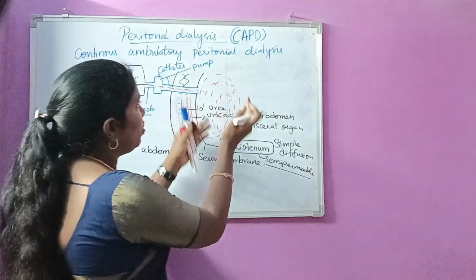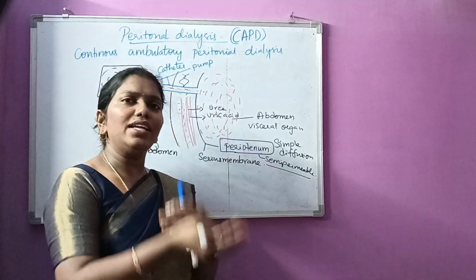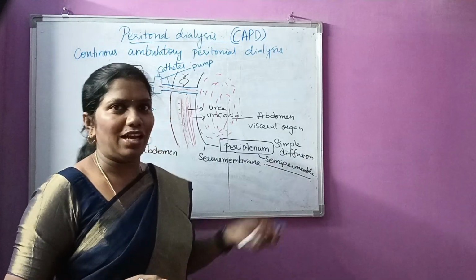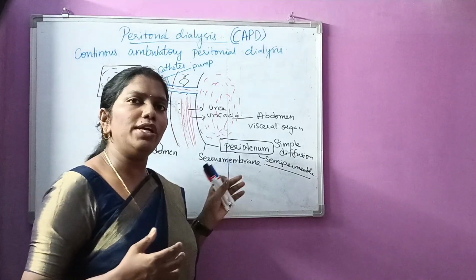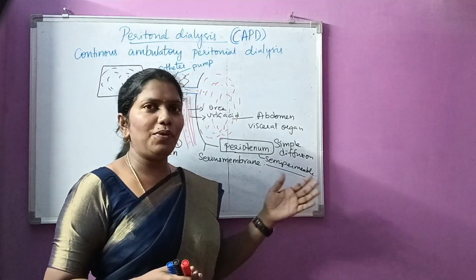Finally, after 4 to 5 hours, the fluid comes back into this packet. It is thrown away and again a fresh packet is inserted. So it is continuous. The person who is going through this process can do their daily activities. I hope you understand this.